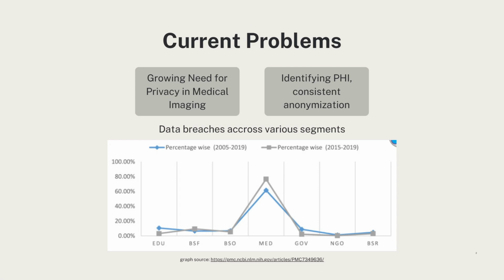These images are saved in a special format called DICOM, which not only stores the picture but also information about patients like their name, birth date, and ID number. While sharing these images is important for helping doctors work together and for medical research, it also raises privacy concerns. This is because these images contain personal details about the patients. To protect privacy, this information needs to be removed or de-identified so that the patient's identity is hidden.